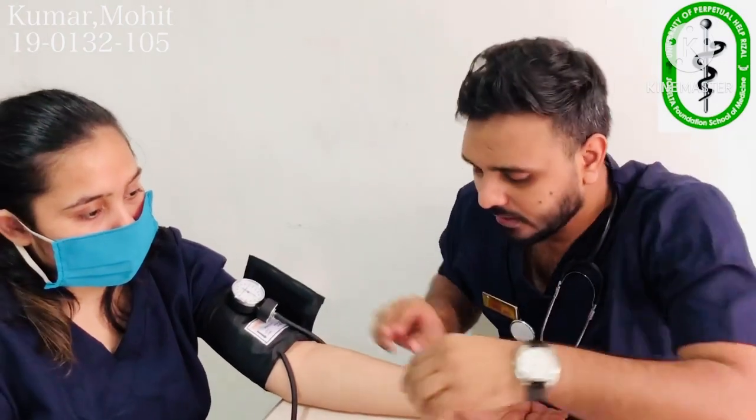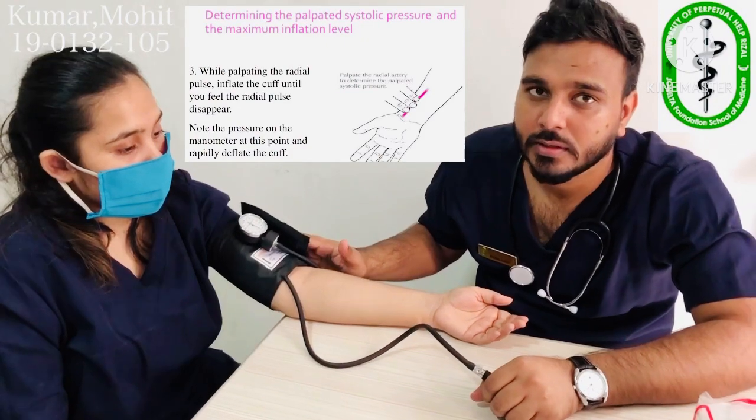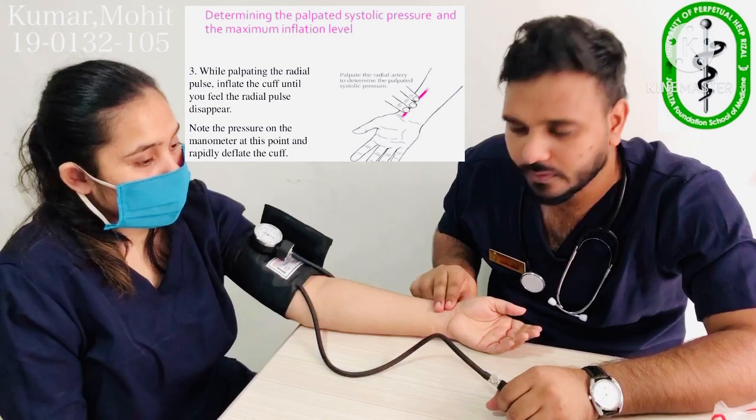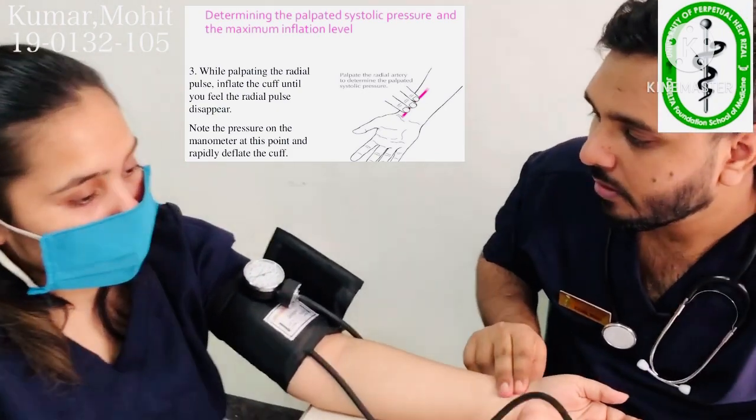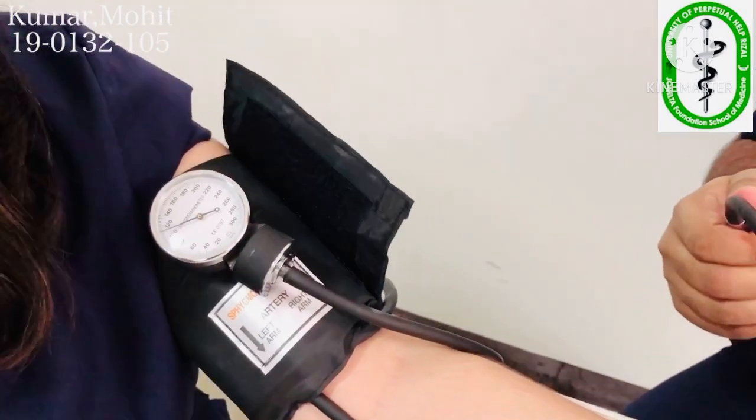Now we are going to palpate the radial pulse first. The question is: up to what pressure do we inflate the cuff? We first take a palpatory systolic point — we feel the radial pulse and inflate up to the point where the radial pulse disappears. It disappeared at about 110. So this was our palpatory reading. Now we deflate and rest for 30 seconds to 1 minute before taking the proper reading.